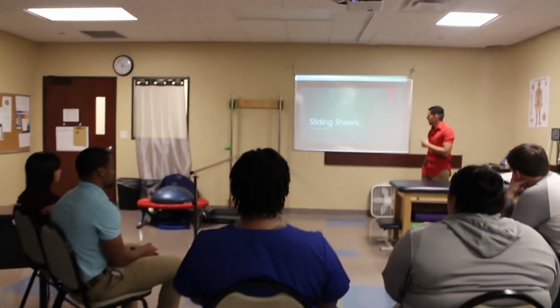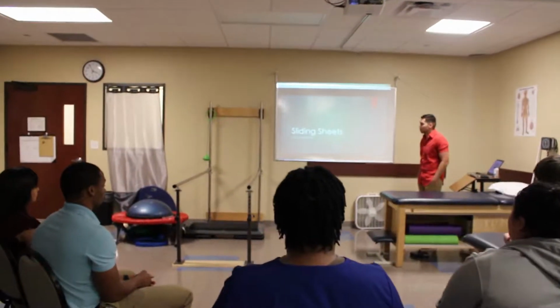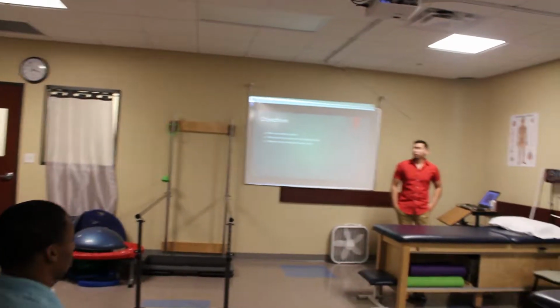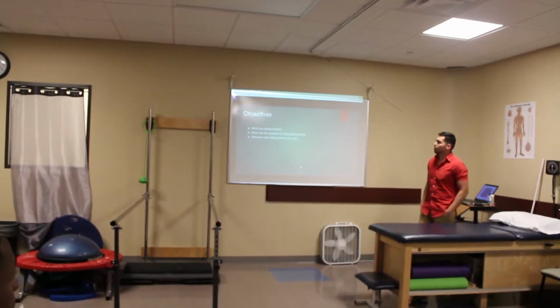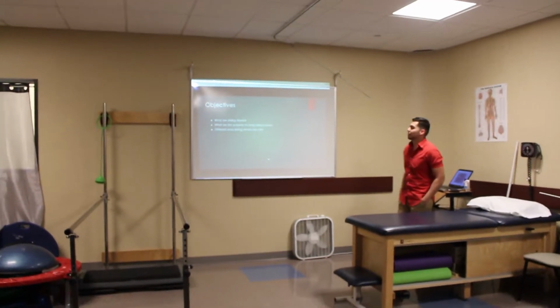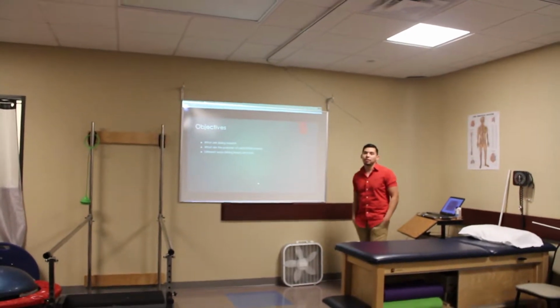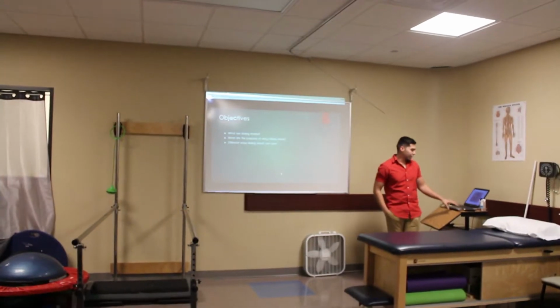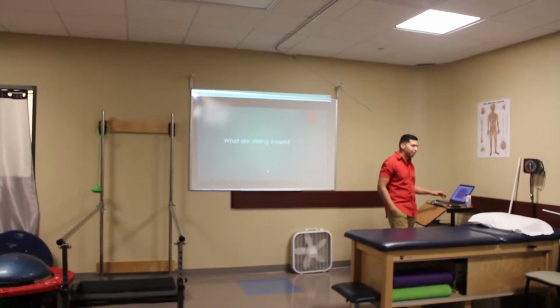Today I'll be going over sliding sheets and what they are. So the objectives will be what the sliding sheets are, what the purpose of using them is, and the different ways you can use them. So have you guys ever seen or heard of sliding sheets?